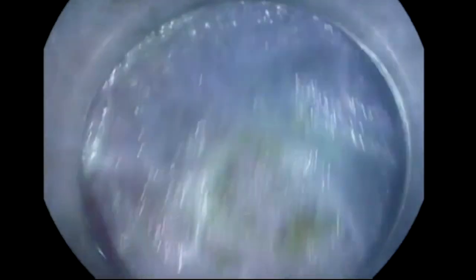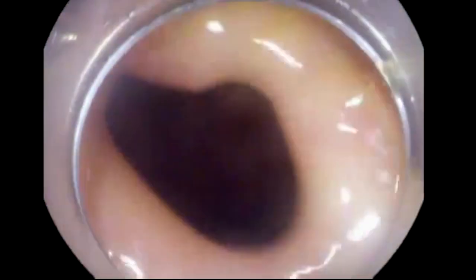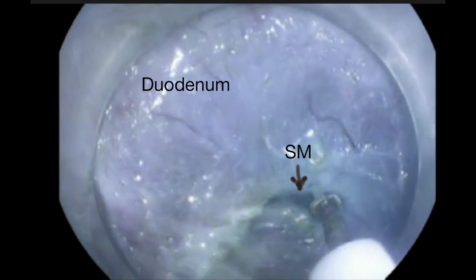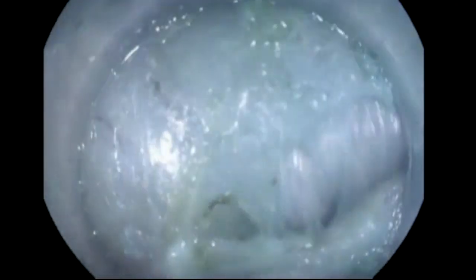As we see here, we're almost dissecting towards the pylorus, and at this point if we come out with the scope, you will find that we are almost at the pylorus. You have to be very careful in this area, because any wrong dissection will cause a mucosal injury. The mucosal surface is up there, the submucosa is this tiny rim here, and I have to inject the submucosa and make sure I'm only dissecting the submucosa without injuring the mucosa.